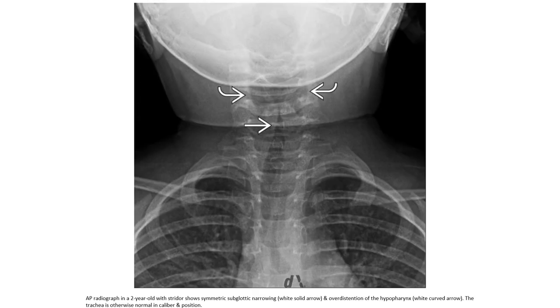Another case of a two-year-old with stridor. Symmetric subglottic narrowing and overdistension of the hypopharynx are present. The trachea is otherwise normal in caliber and position. This is again consistent with croup.